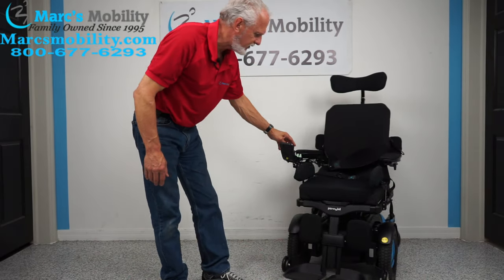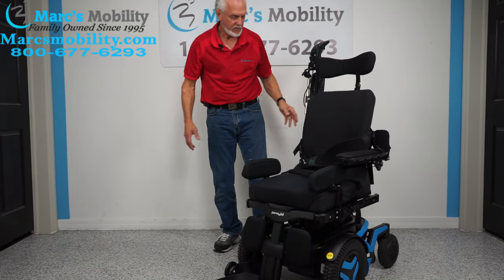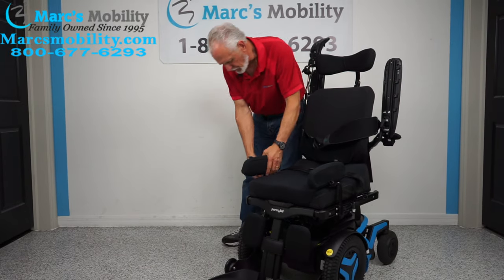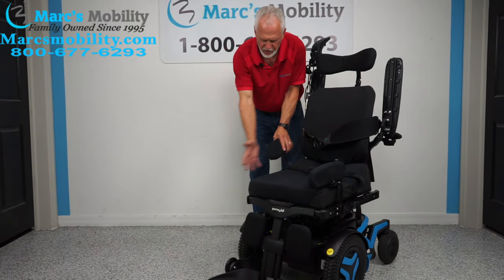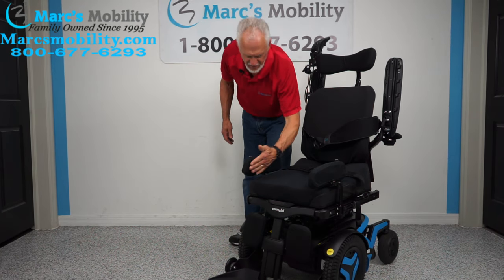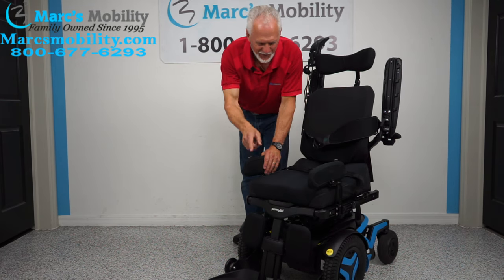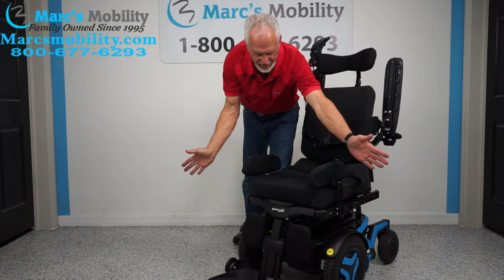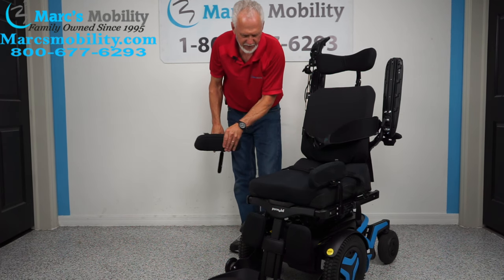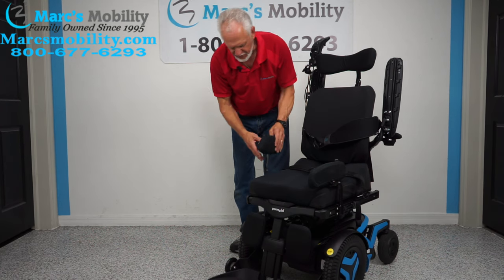Let's look at the front. You have calf pads here and laterals. The arms go up, so if you transfer from the side you would remove these pads right here. These lateral pads keep your feet on the foot plate and keep your knees from buckling out and hitting a door. They can be moved in, down, back and forth — there are tons of adjustments. These are lateral knee pads.